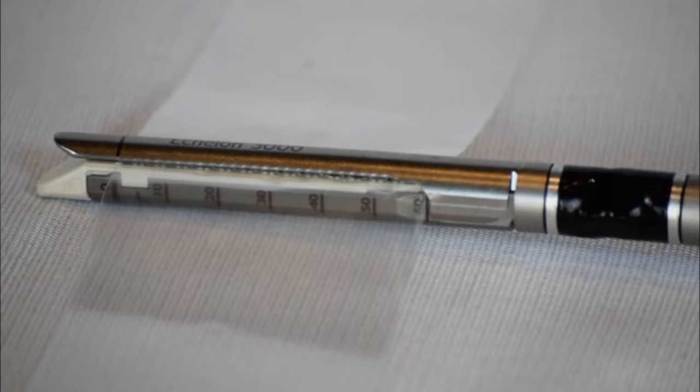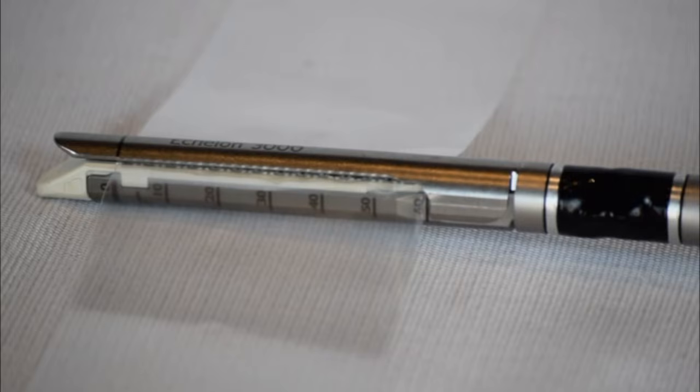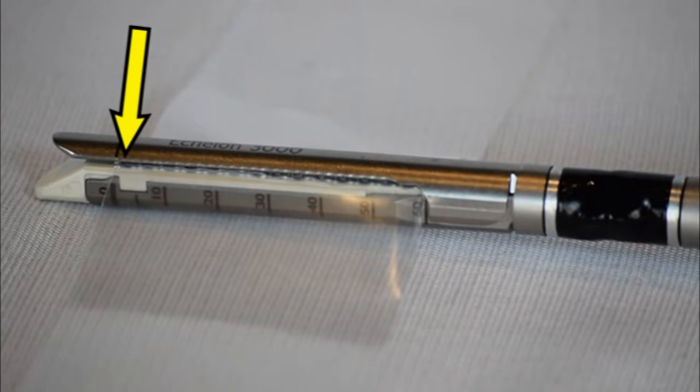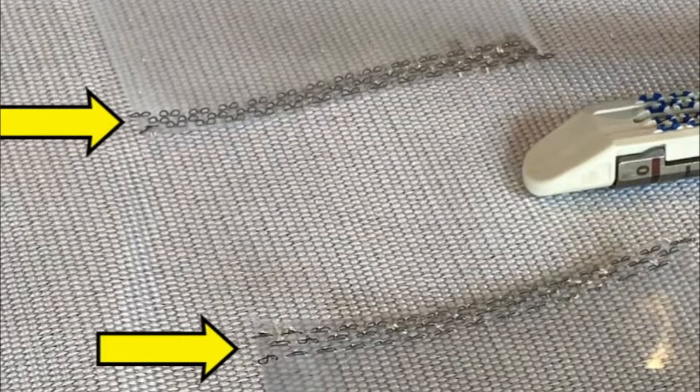Now I'm going to place a hollow bag which will simulate the bowel inside the jaws of the stapler, and I'm going to close it down and fire it across this bag. And you can see here the staples as they're being fired across this bag. I'm going to open this up and pull this bag out, and you can see those rows of staples fired right here, and the bag is sealed and cut.